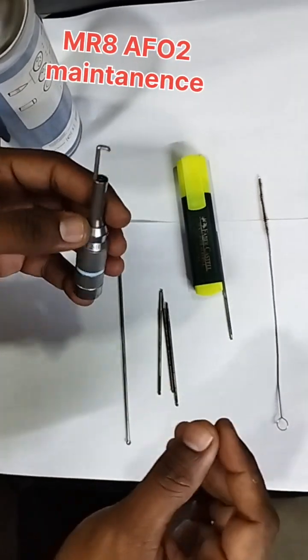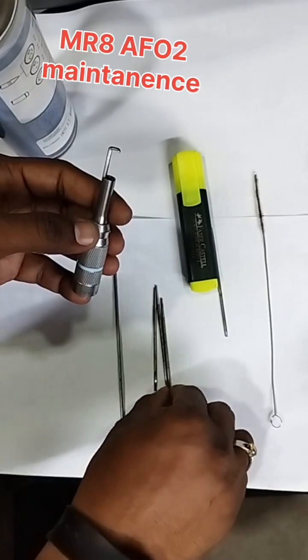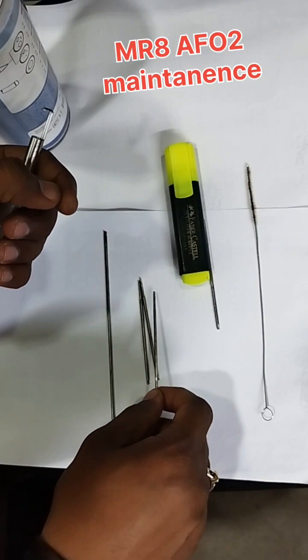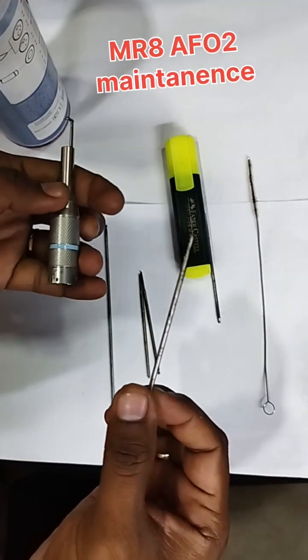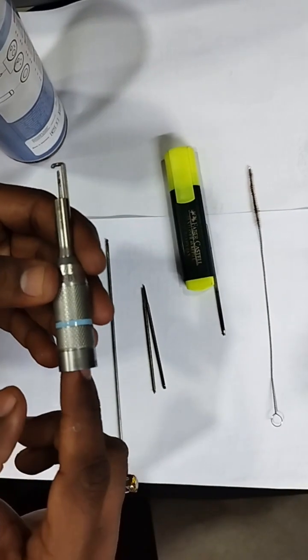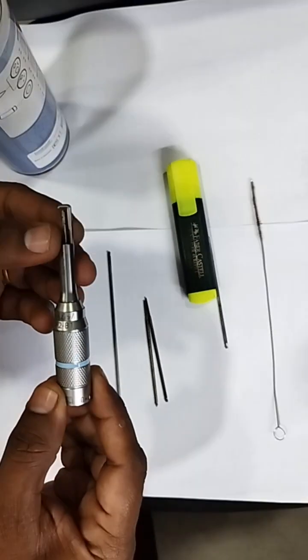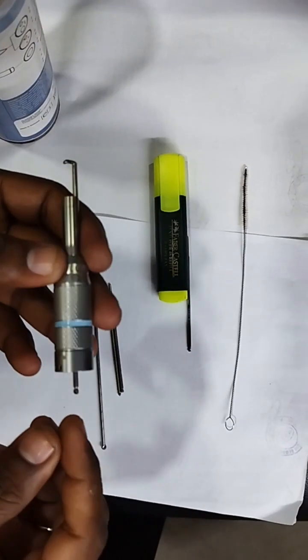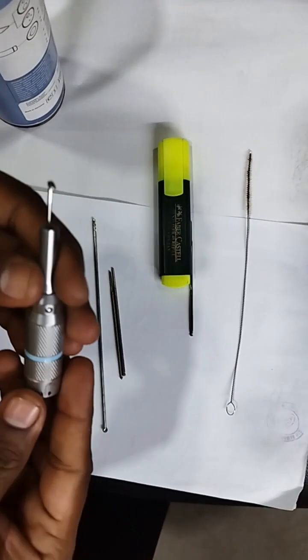Initially when you are using a new tool, no need to check it because it is a new tool. But this is a used tool — maybe used two or three times. So before connecting to the motor, first insert the tool and check whether it is going to the tip of the hooded part. Always have a habit to insert the tool before connecting to the motor.